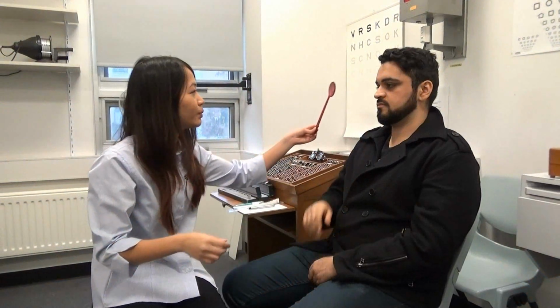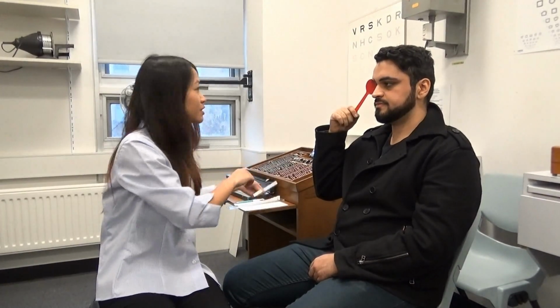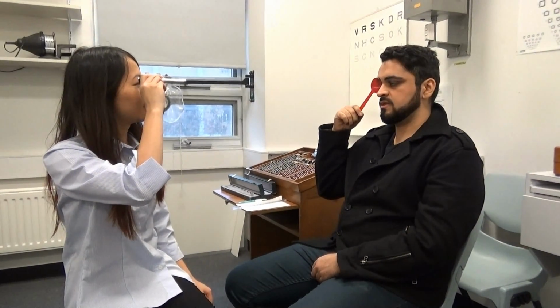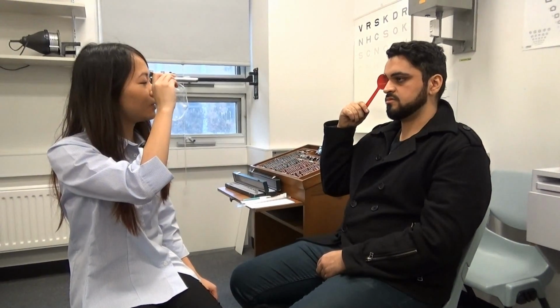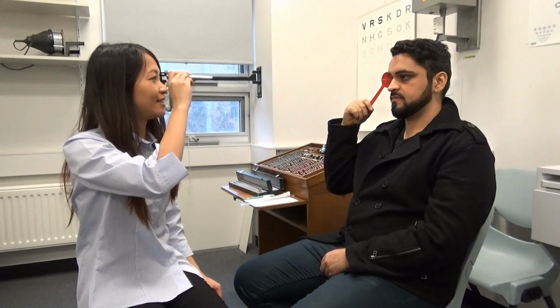Okay, so now I'll be putting it in an opposite direction. So I'm just going to repeat the procedure. So do you see the light? Yes. And do you see a red line? Yeah. Is it vertical or horizontal? Horizontal. And where is the light in regards to the red line? It's on the line. So it's spot on the line? Yeah, okay, that's good.